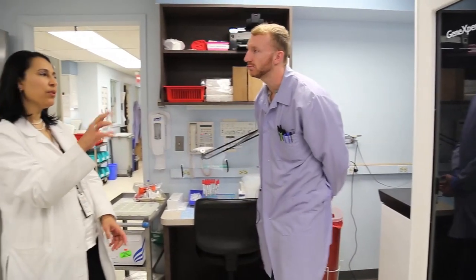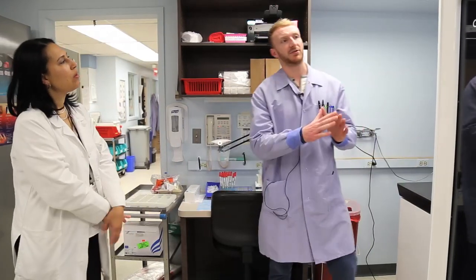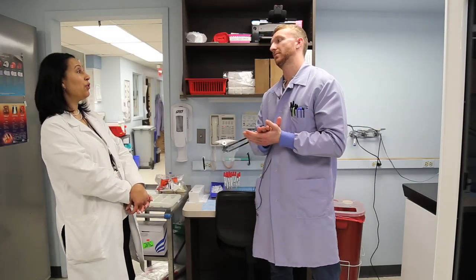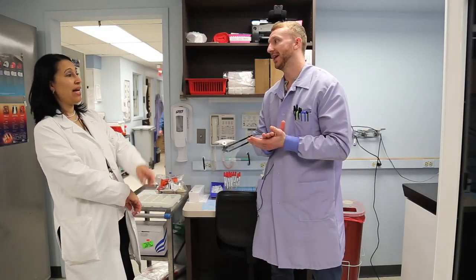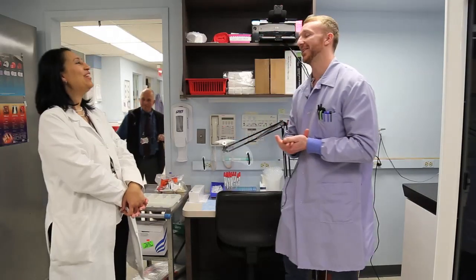So does it beep or something prints out, or how do you know when it's ready? It actually auto-files. Let's say, for example, you have a stool sample that comes in for C. diff. It gets put in the cartridge, loaded onto the instrument, does a PCR for 1 hour, and then it automatically goes into the patient's EMR. So you all don't have to do anything after that? Nothing. Don't tell people that, because we want to make it look like we do something. But yes, you're exactly right.